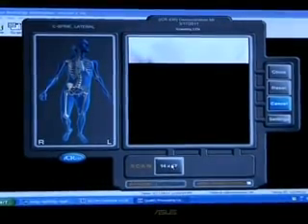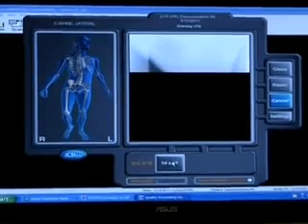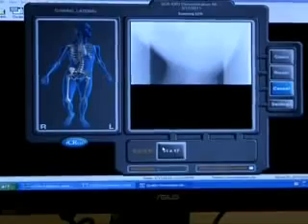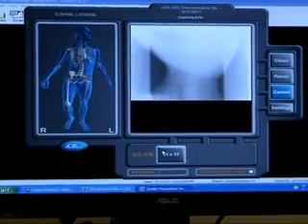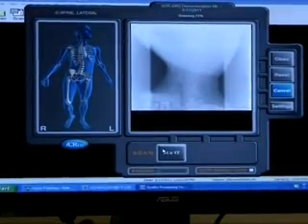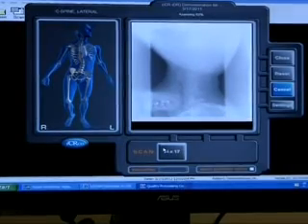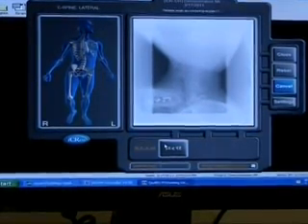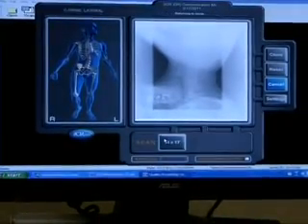So it takes about 15 seconds in total for us to process an image, which would take us 15 minutes to do before, where we'd have to actually take the whole series of X-rays on plates, which means actual films, take them out of the room, bring them into another room, and then process it like in a dark room. So that's all eliminated. Right.